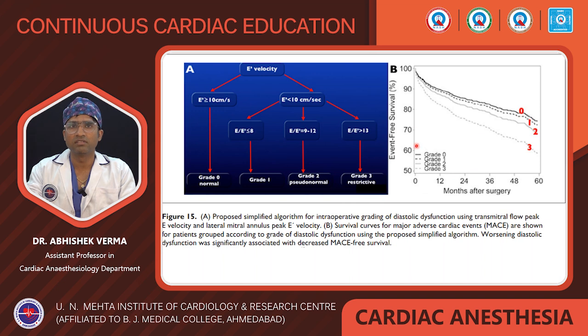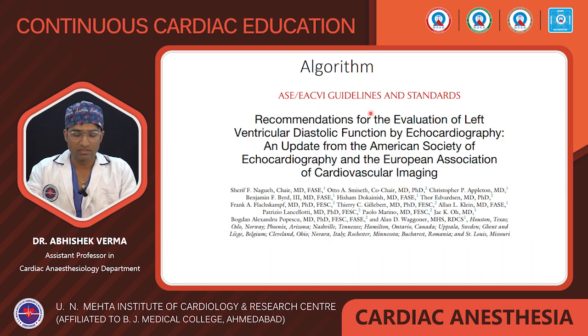And this is a diagram which shows the event-free survival in diastolic dysfunction patients. Event-free survival is high if there is no diastolic dysfunction, and very low in patients with grade 3 diastolic dysfunction. Next, there are some guidelines on the basis of which we assess diastolic dysfunction, but we can do it in the transthoracic echo much better as compared to transesophageal echo.